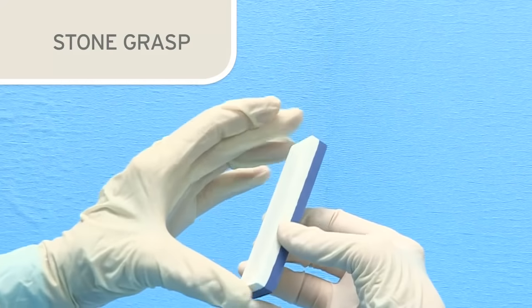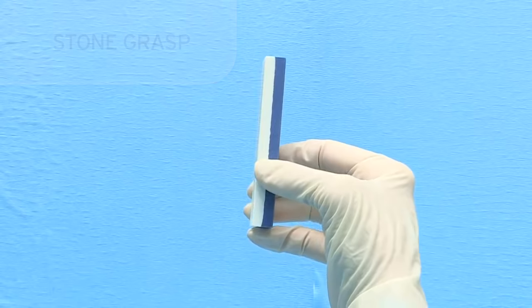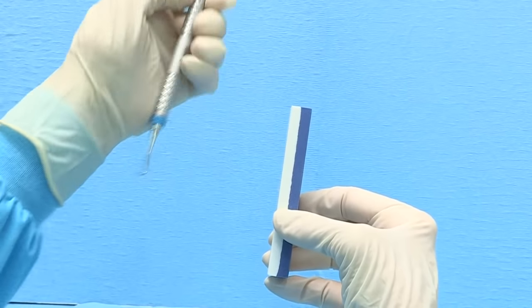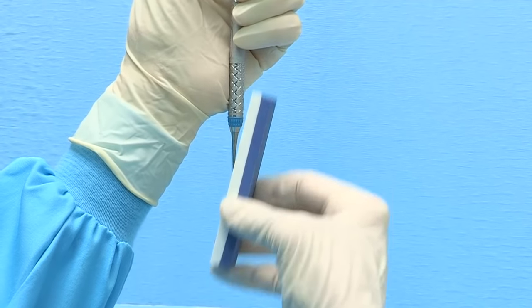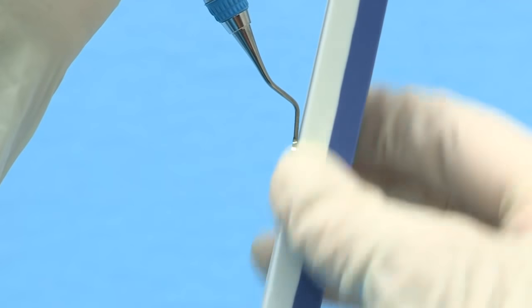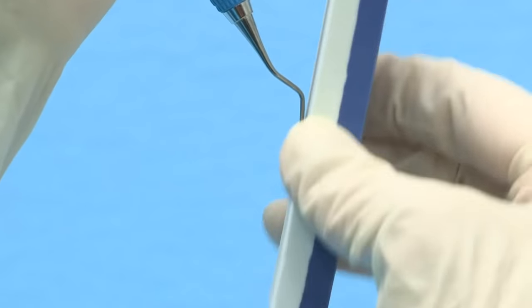The same stone grasp is used when sharpening either sickle scalers or curettes. The grasp should be on the lower half of the stone with the thumb on the edge toward you and fingers on the edge away from you. This stabilizes the stone and assists in maintaining a consistent vertical motion during sharpening, and will also minimize the tendency to move the stone with a rotating or rolling motion which may dull the end of the blade.